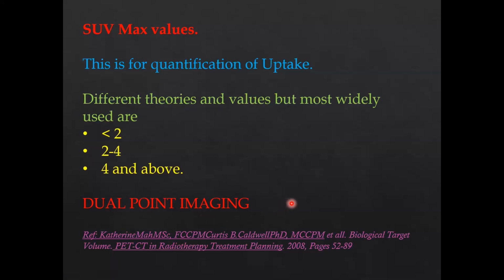It is a delayed PET imaging after a proper PET whole body, probably after 1 hour, 2 hours, 3 hours, or 4 hours, depending on the case, depending on the clinical symptoms and the area of interest. But here the concept is, if you are doing a delayed scan after 1 hour, then whatever SUV values you have got after a proper PET, in the delayed scan, if the SUV values are same or increasing, then probably it goes more in favor of malignant lesions, because the concept here is malignant tumors or malignant cells will have a capacity to retain the tracer uptake within the cells.